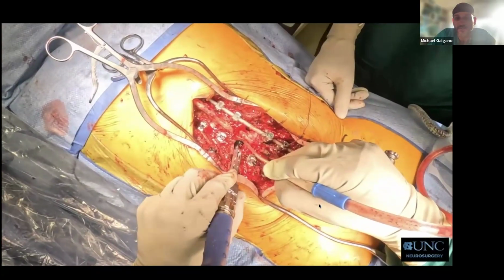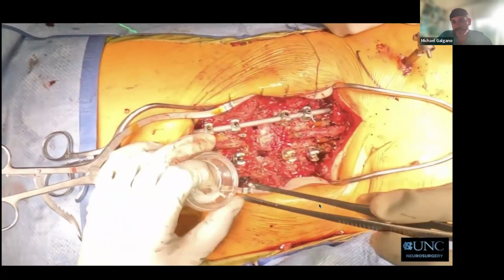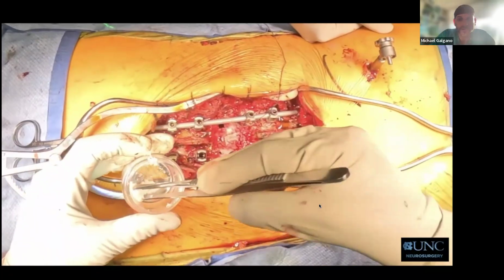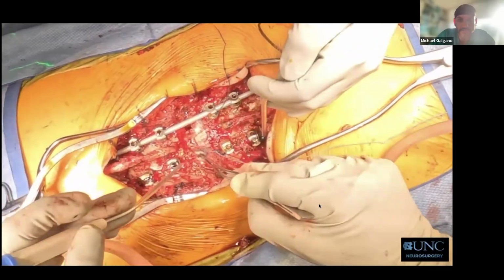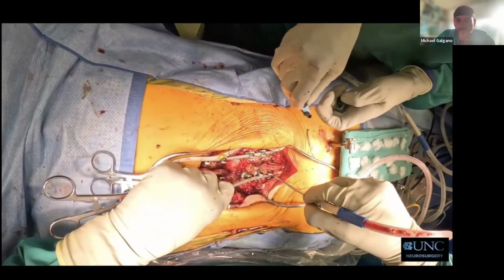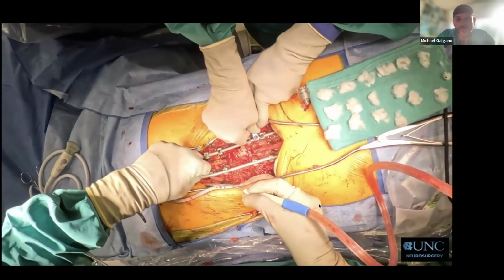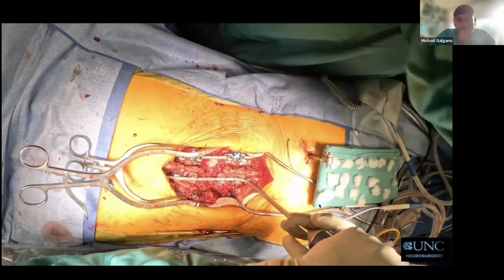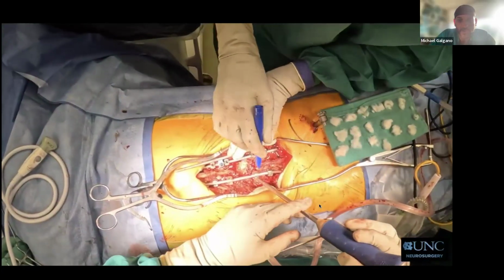But it is important in these infection cases that if you're going to do a corpectomy, you want to make sure that you're landing on a relatively normal vertebral body radiographically, because if you don't, what will happen is that your cage will subside into the vertebral body above, or the cage will actually migrate because of the amount of asymmetry that there is to the end plate. So in a case like this, it really required us to do essentially a two-level vertebrectomy from the back, which is what we did. Now that the cage is in, we're able to put the ipsilateral rod in.